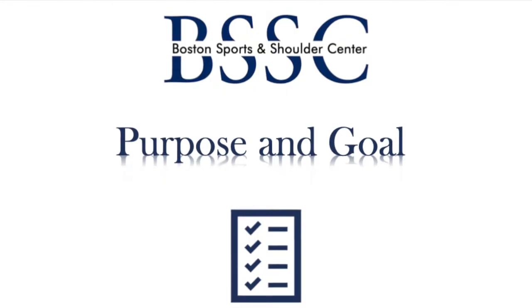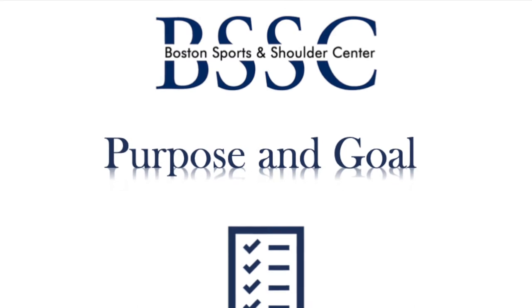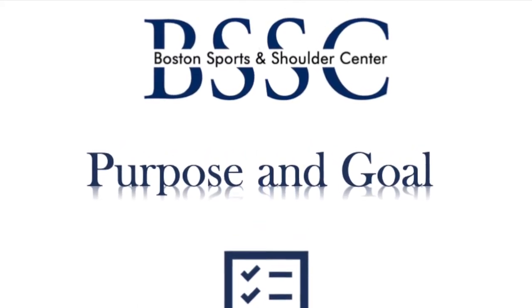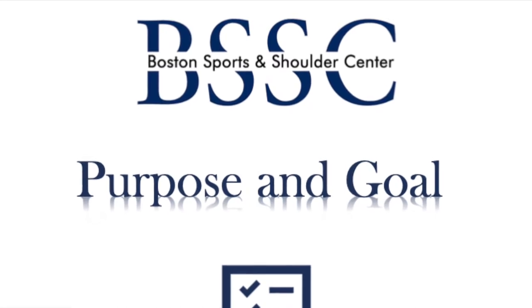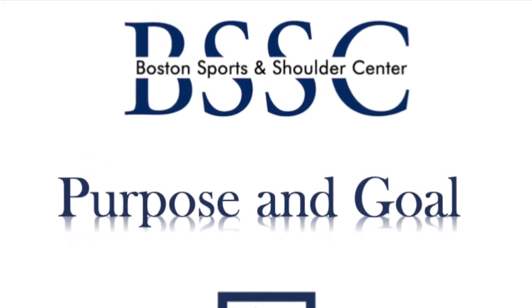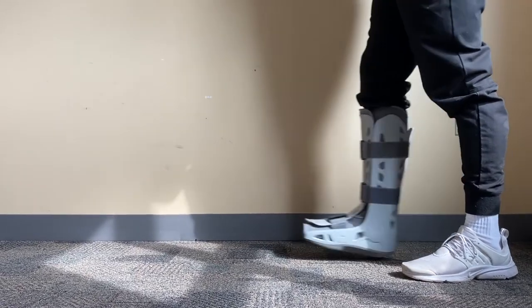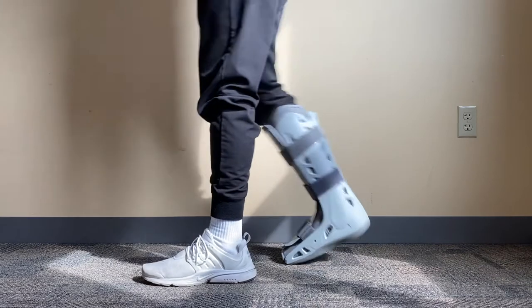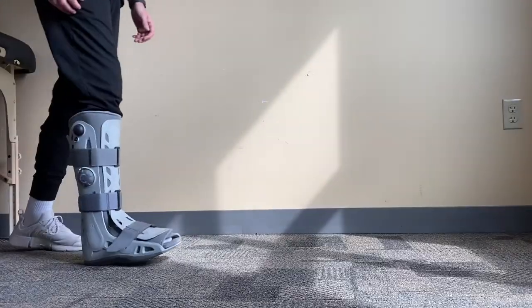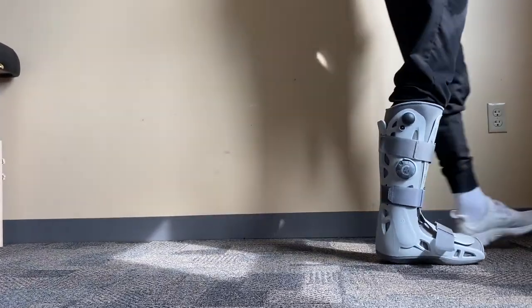The purpose of a walking boot is to provide a comfortable means of immobilization and protection following a foot or ankle surgery, injury, or condition. The boot has a rocker-style sole. This feature helps simulate a normal gait pattern during the healing process and can easily be paired with an assistive device such as crutches or a walker to make ambulation safe and easy. This is dependent on your weight-bearing status and you should never progress your status without instruction from your provider.